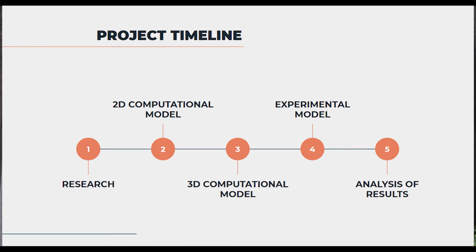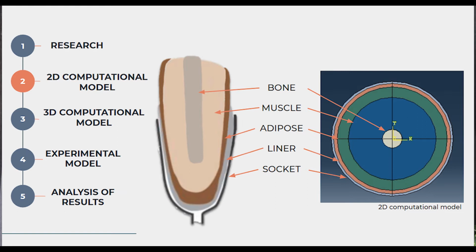Once our scope had been defined, we were able to plan the logistics of generating useful results. We began with simplified computational models so that both the models and results could be easily verified and understood. We then stepped it up to more complex and thus more accurate simulations and models. We began with a two-dimensional cross-section of a simplified assembly with a uniaxial load. This load was taken as the highest component of force experienced at the flat foot stage during the gait cycle, where the maximum loads are experienced.